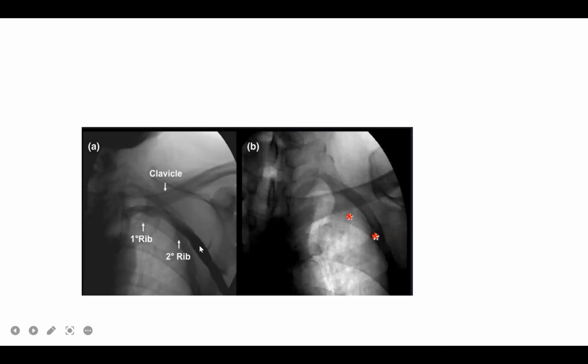Now, the venogram is that I remember when I was still training in India, where I was in Apollo Hospital, we usually do a venogram before we take any puncture. So the venogram, if your center is the one that does venogram, with what I describe as under fluoroscopy puncture, they are all similar. So you can even try it, get a venogram, see where the subclavian vein goes through, then take under fluoroscopy puncture, you will notice that that vein goes through the same point that we just described above.